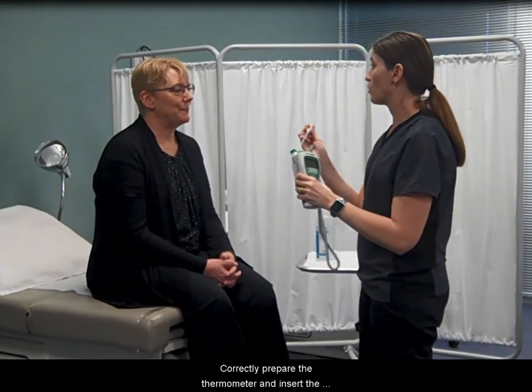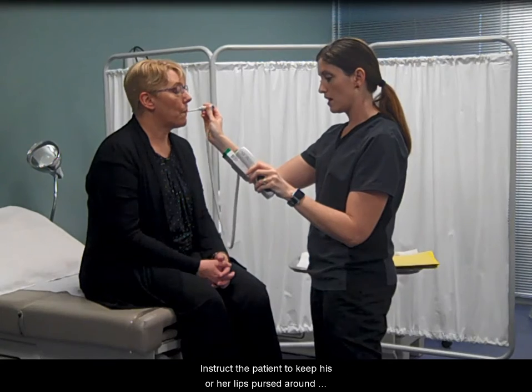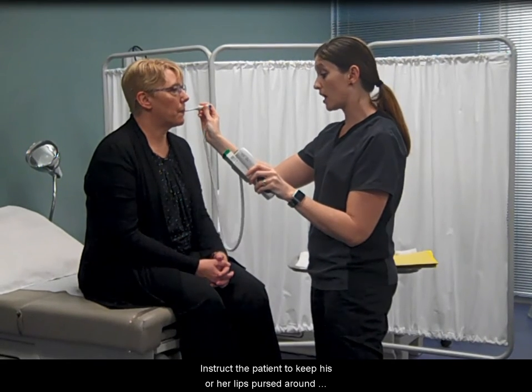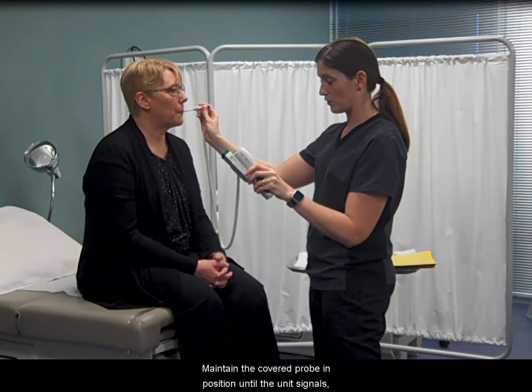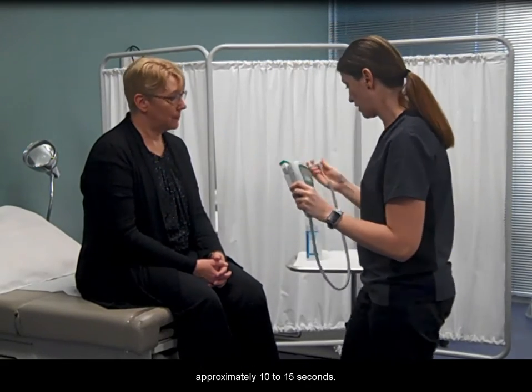Correctly prepare the thermometer and insert the covered probe into the patient's mouth. Instruct the patient to keep his or her lips pursed around the probe and not to bite down. Maintain the covered probe in position until the unit signals, approximately 10 to 15 seconds.